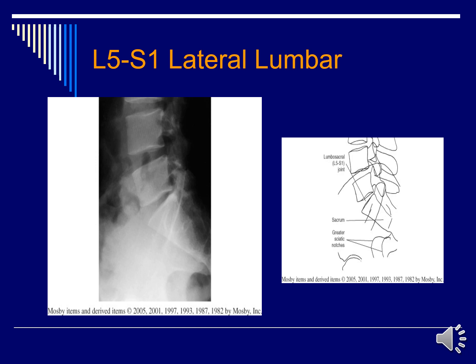Then when I do my L5-S1, I already know the central ray location because I go 1.5 inches below the iliac crest and 2 inches posterior. So the oblique is 1.5 up and 2 in, and the L5-S1 is 1.5 down and 2 back.